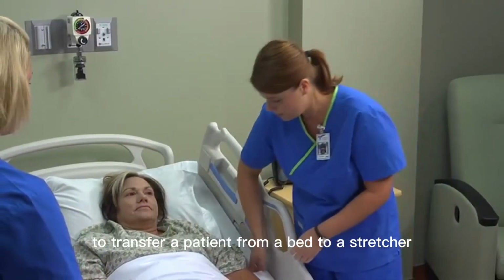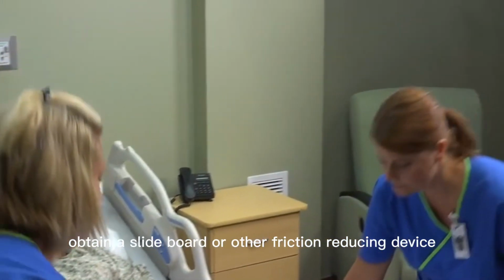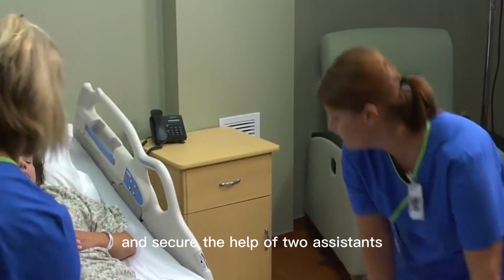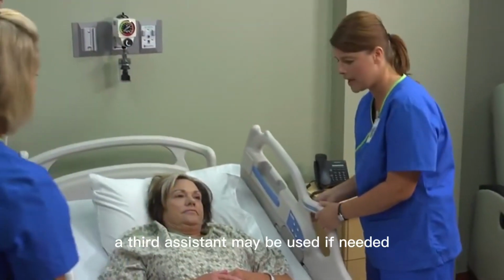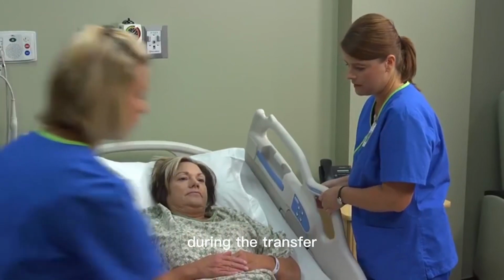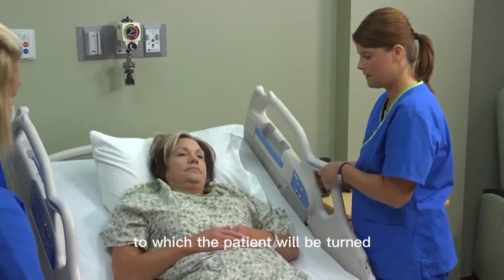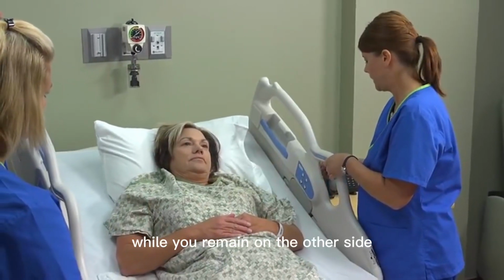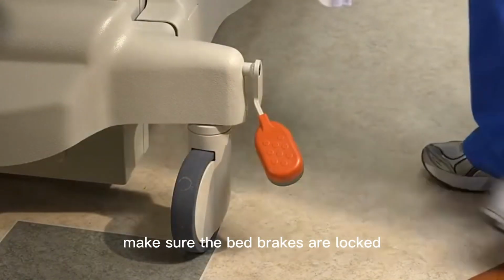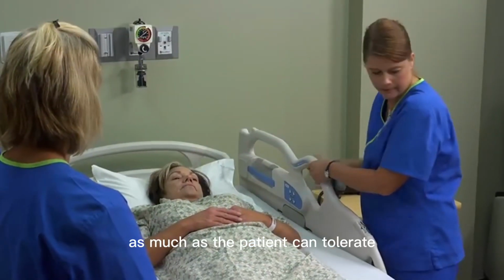To transfer a patient from a bed to a stretcher, obtain a slide board or other friction-reducing device and secure the help of 2 assistants. A 3rd assistant may be used, if needed, to support the patient's head and neck during the transfer. Raise the bed and position 2 assistants on the side of the bed to which the patient will be turned, while you remain on the other side. Make sure the bed brakes are locked. Lower the head of the bed as much as the patient can tolerate.